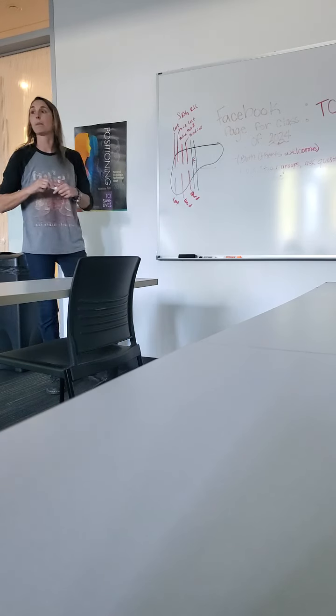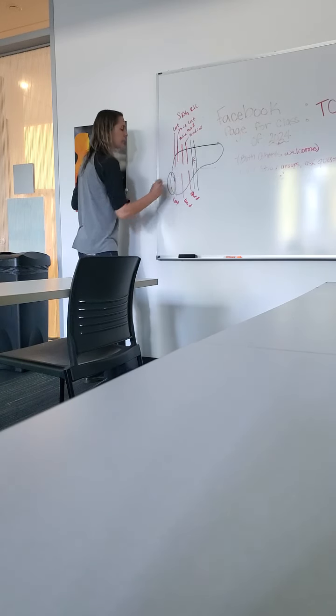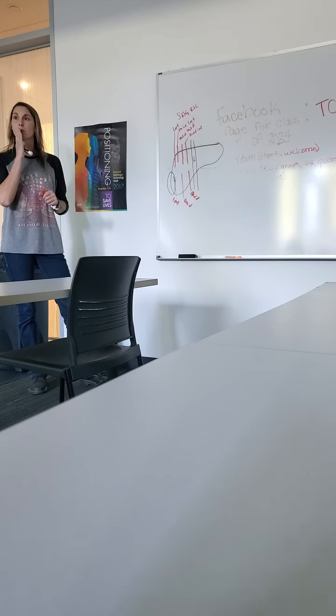So 4 across the top because he's so much bigger, using that subxiphoid neighborhood, sliding down our costal margin and getting those bottom 3, a medial, a mid, and a lateral. Where we end with this lateral just happens to be right kidney land and what we call the midclavicular. And what do we do with the midclavicular? What's that our landmark for? Measuring the liver. Oh, that's right. Remember, we measure the liver in the midclavicular plane, that right liver lobe.